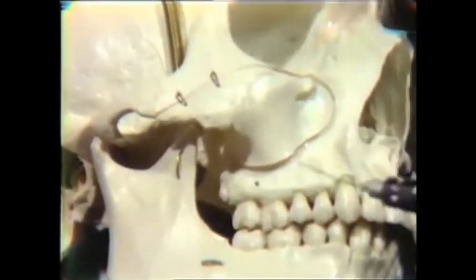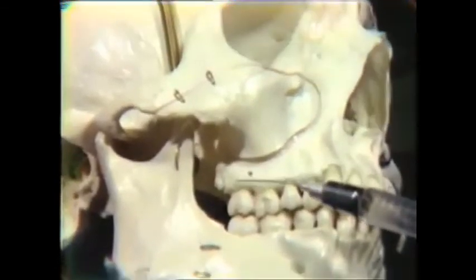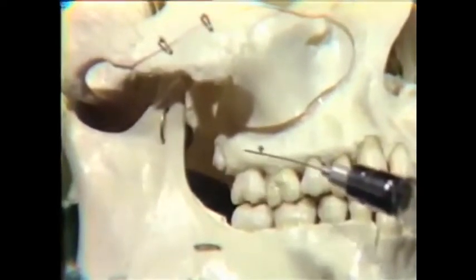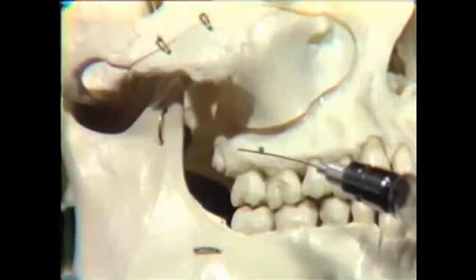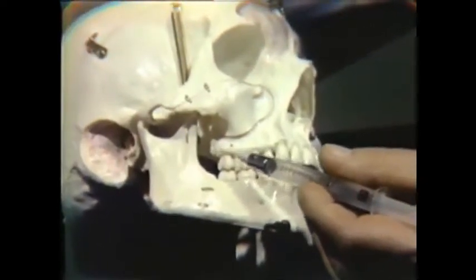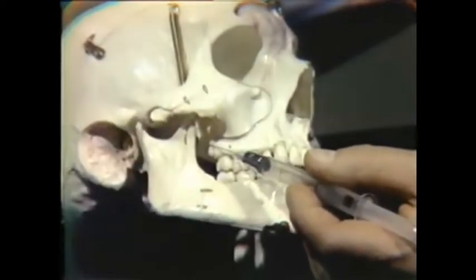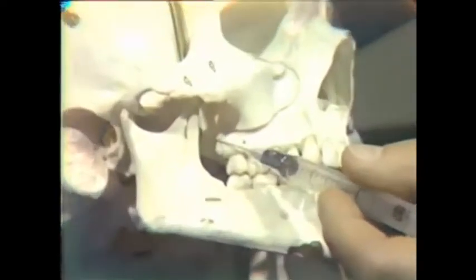So we make the approach, and my needle puncture will be well out in the vestibule and approximately at a level of the second molar. And now if you can watch and see how I maneuver the syringe in an attempt to stay close to bone. I'm carrying it superiorly and laterally so that as we approach the foramina area, I'm going to be hugging the side of the tuberosity so that we stay close to bone and out of the pterygoid plexus of veins.